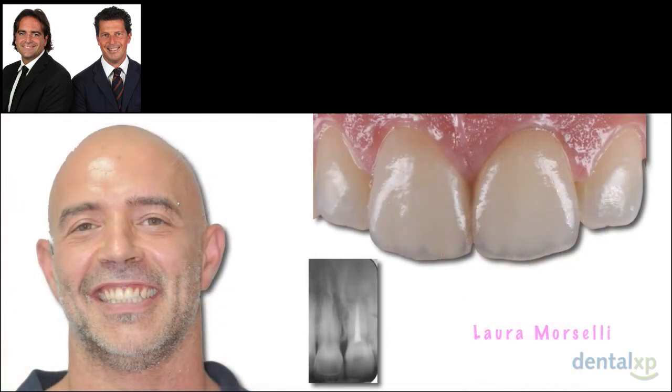This is the final restoration, lithium disilicate restorations. As I was saying, a veneer on number 8 and a full crown on number 9. Done in a very good way by one of our dental technicians, Laura Morselli.